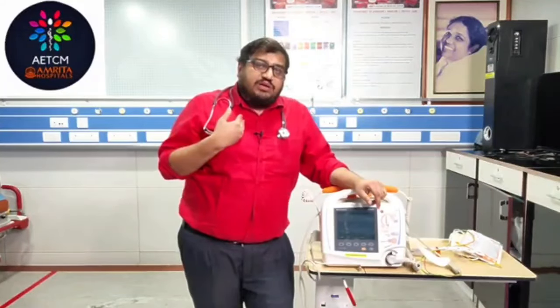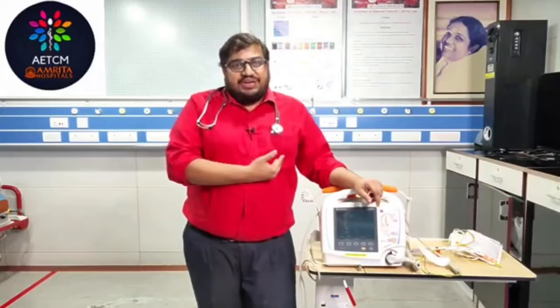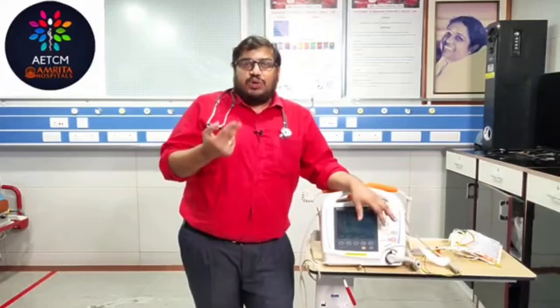Where to keep the paddles: I said one over the right side of the chest, just lateral to the right border of your sternum, and one over your apex, that is your anterolateral. Then you have your anteroposterior. Right side it is the same, and posteriorly just below the tip of the left scapula. Those are the two positions.